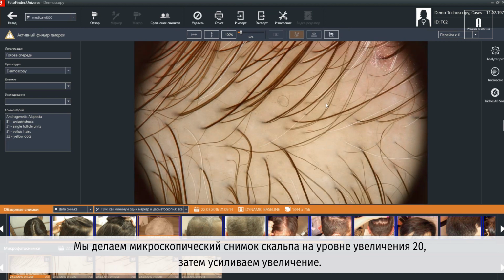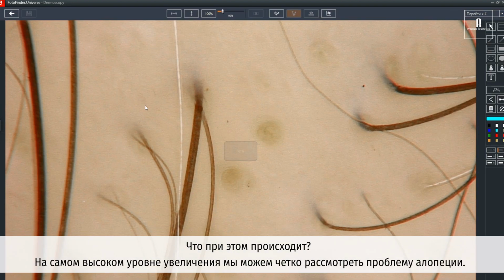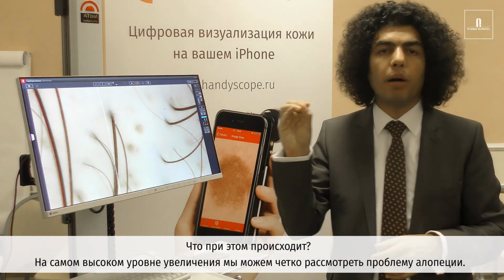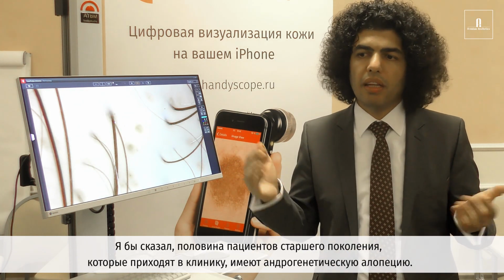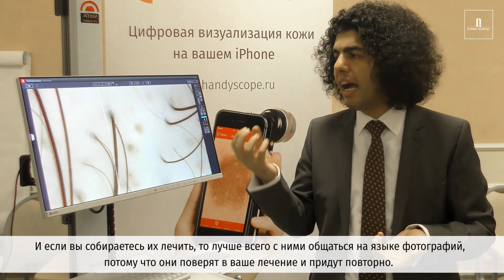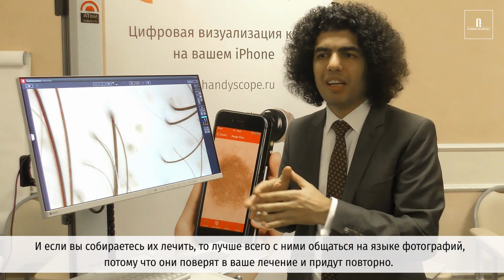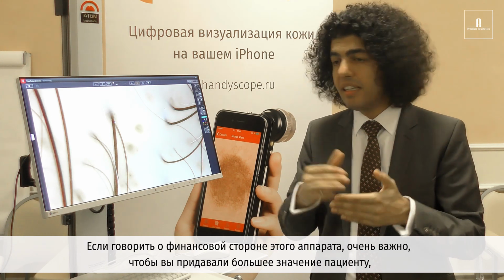So we take a microscopic image of the scalp at 20 magnification, and then we increase the magnification. What happens? At a very high level of magnification, you are able to perfectly visualize the problem of alopecia. In this case, androgenetic alopecia. I would say almost half of all the patients who come to the clinic have androgenetic alopecia. And if you want to treat them, it's good to communicate with them with pictures, because they rather believe in your treatment and they come back and stay in the process.